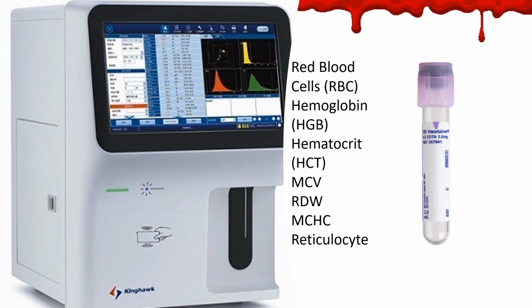If this hematocrit is also lower than normal, that suggests anemia. But again, I have to compare with previous exams in order for me to be able to say I need to treat this patient, or this patient's hematocrit is going up or is going down.